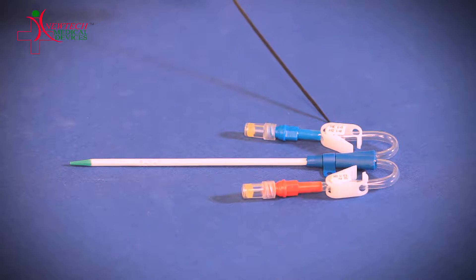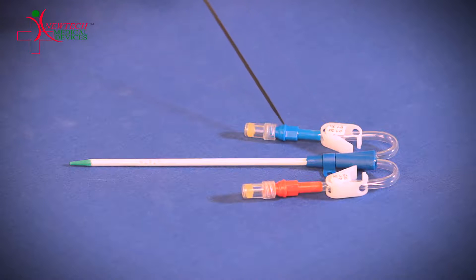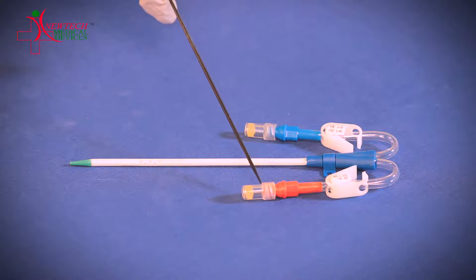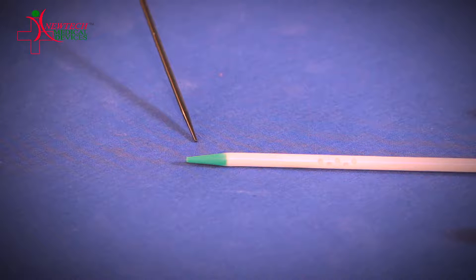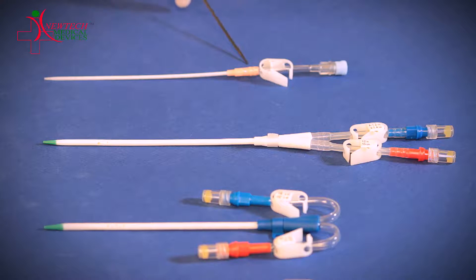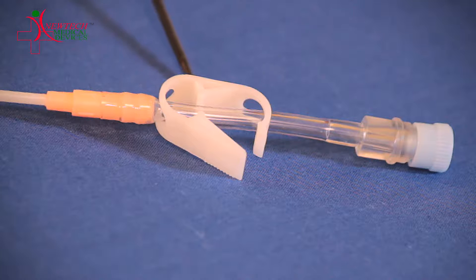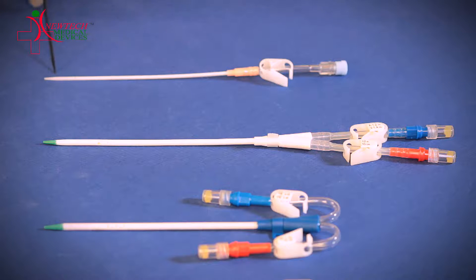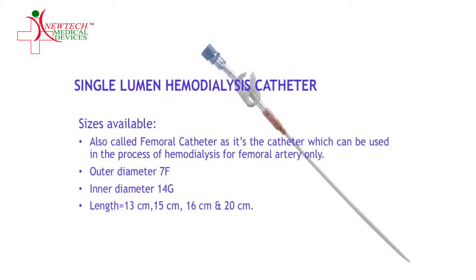This is a double lumen catheter. It is called double lumen because it has two ends: one distal end and one proximal end. Its tip is very soft. This catheter is available in various lengths and diameters. This is a single lumen femoral catheter. This is the blue cap to close the open end, and this is the pinching clamp. This catheter is available in different lengths: 13 cm, 15 cm, 16 cm, and 20 cm, with an outer diameter of 7 French.